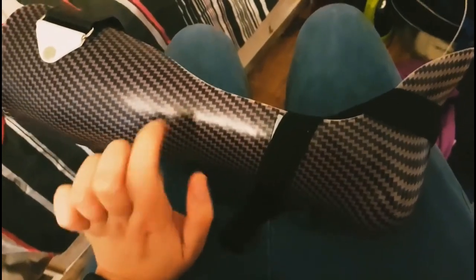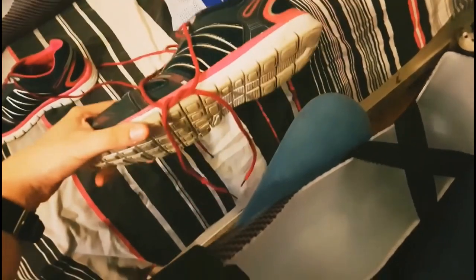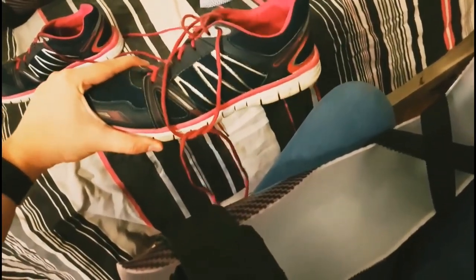As I said, solid plastic, you can hear it there. And there's the other one as well. And you're only allowed to wear trainers with these. You can't wear dress shoes. And again, they won't provide you with orthopedic shoes, but beggars can't be choosers, like. To open it and put it on, you just undo all the straps. And then the same with the bottom figure of eight strap. And then you insert your foot in there and do up all the straps again. Sorry, this is really hard to do one-handed.